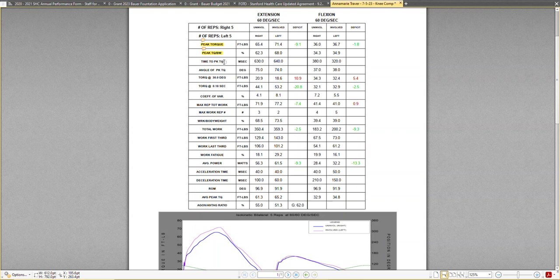Rate of force development is such a volatile metric that usually you need a rigid shank to measure it, meaning an isometric test rather than an isokinetic one. The second issue is that this can have the flaws of the individual pre-tensioning.